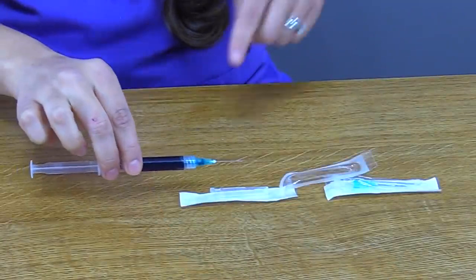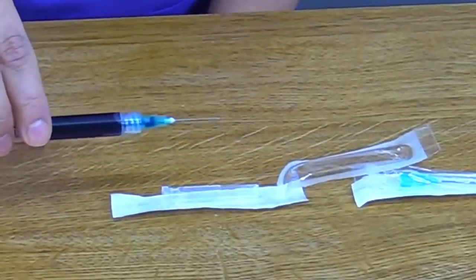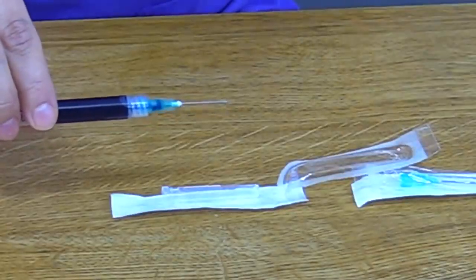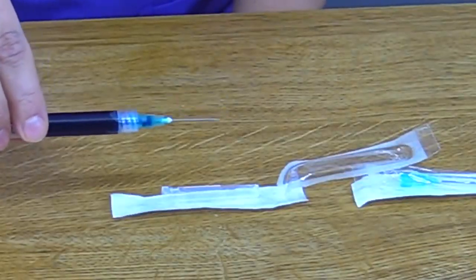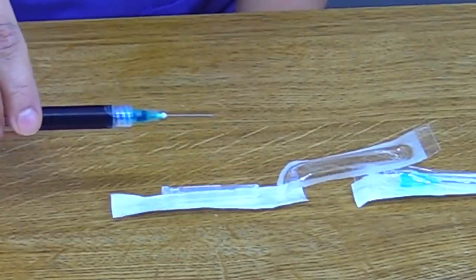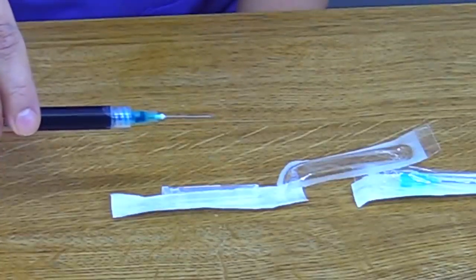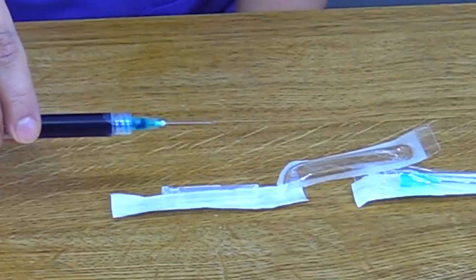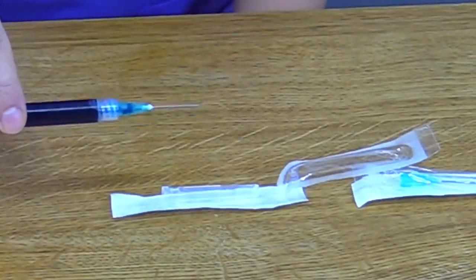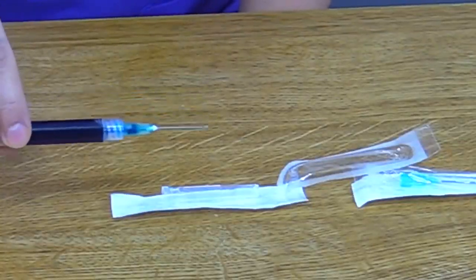And now we're going to remove the needle that we used to withdraw the medication from the vial and apply a new needle to actually administer the medication. And this would be the same case if we use a filter needle or one of those blunt tip fill needles. You would always change that out. Now, why do we want to change this needle out? Why wouldn't we use it to give it to the patient?